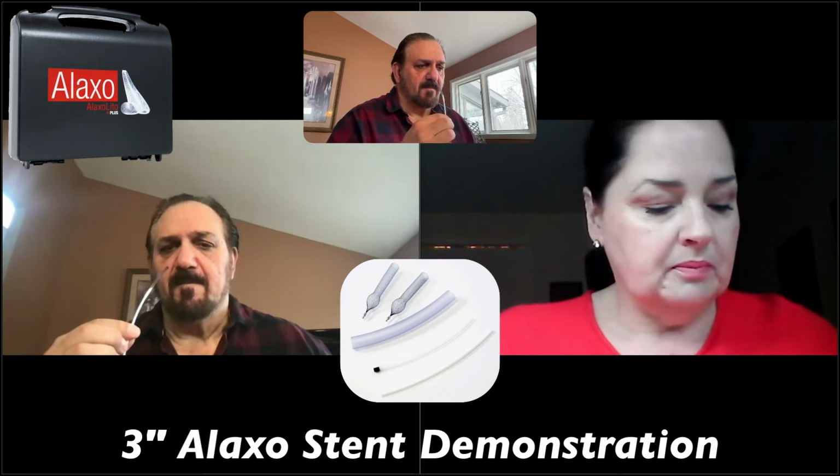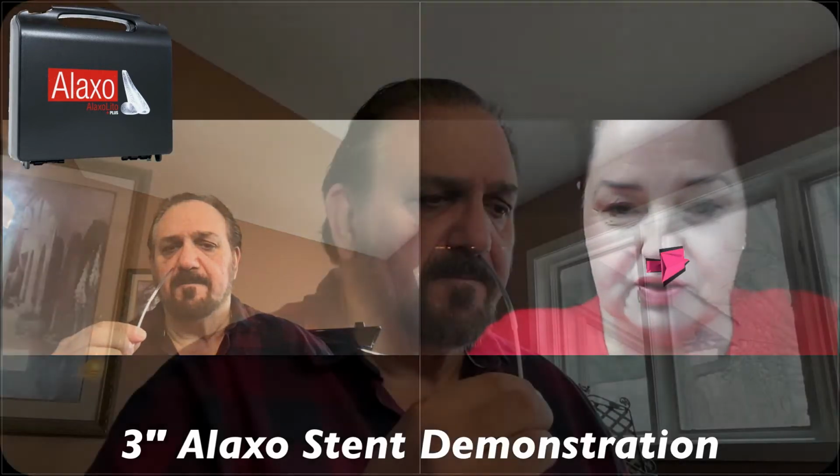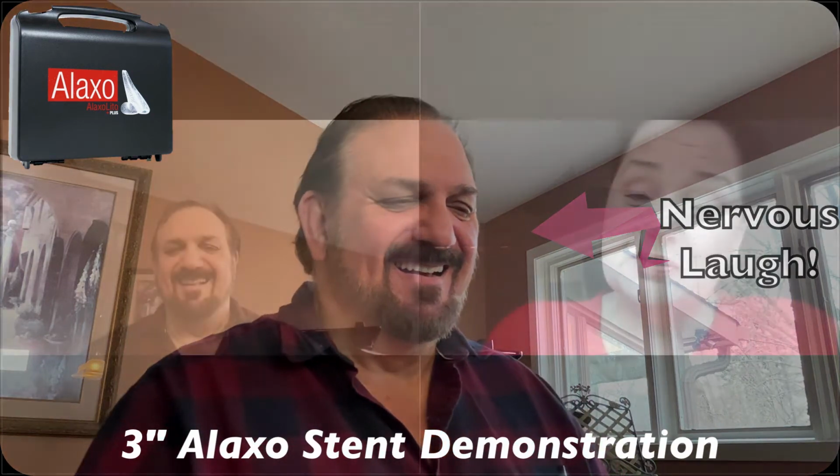I'm just going to talk to you a little bit about what this is going to feel like when you put it in. Have you ever had your nose scoped? Endoscopy? I can't recall ever having an endoscope put in my nose, no. These are actually just a little bit smaller than the scopes that are used by the ENTs to do the scoping, so it's no more or less uncomfortable than that. Also, we want you to know that it's going to be uncomfortable because you're inserting something into your nasal cavity, but it's not going to be painful. And it shouldn't be painful.